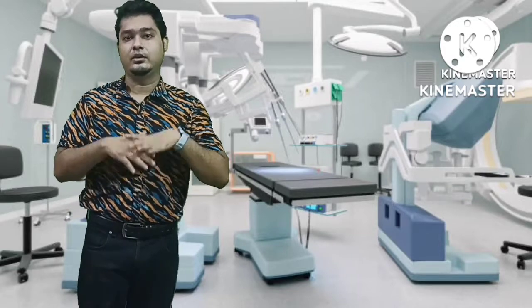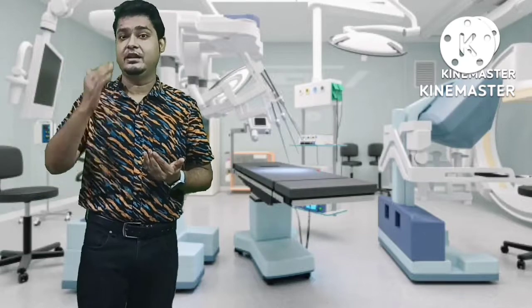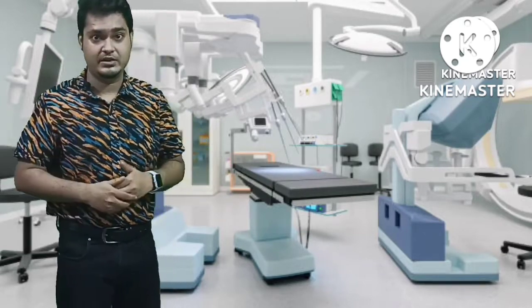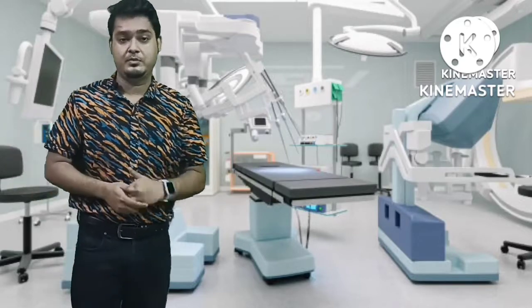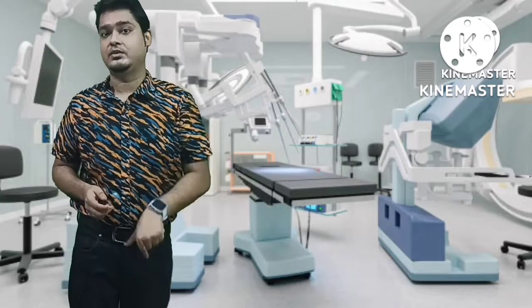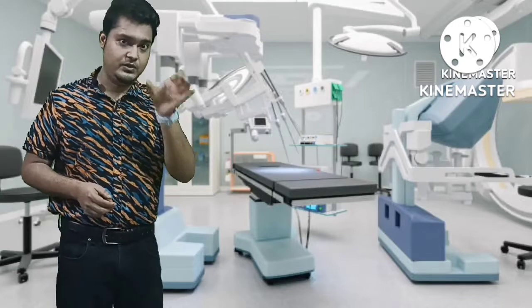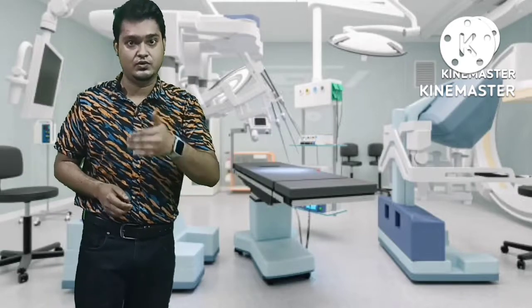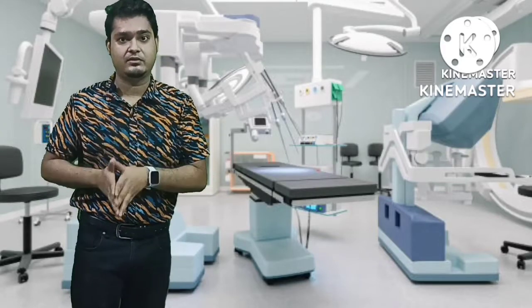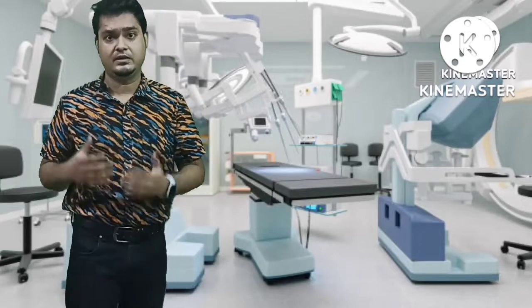And because in CT coronary angiography you are using a higher amount of contrast media, this increases the chances of contrast media-induced effects in the patient's body. Okay, but because in traditional catheter angiography you are using a lesser amount of contrast media as compared to the CT scan, it basically reduces the chances of contrast media-induced effects in the patient's body. So on the aspect of contrast media-induced effects, catheter angiography is safer as compared to CT coronary angiography.